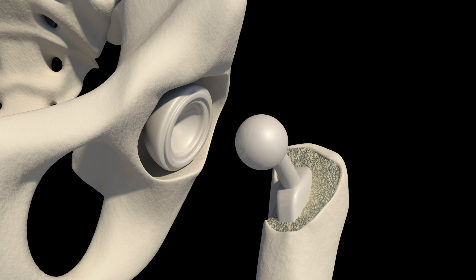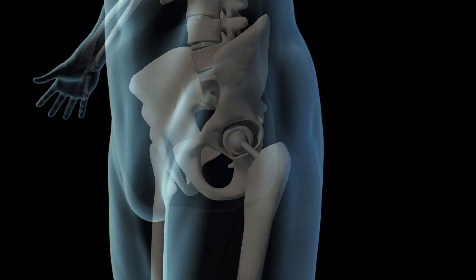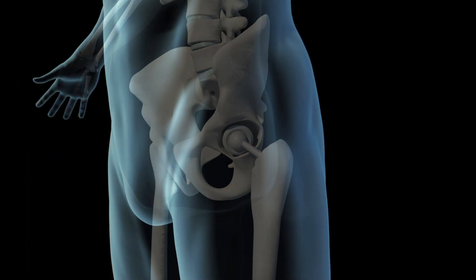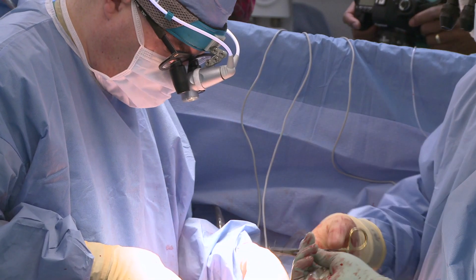Once both components are firmly in place, the prosthetic femoral head slides into its acetabular counterpart. From here, the surgeon tests the movement of the new hip joint, verifying it is properly positioned with an X-ray.